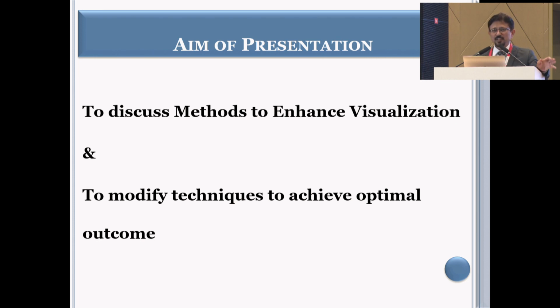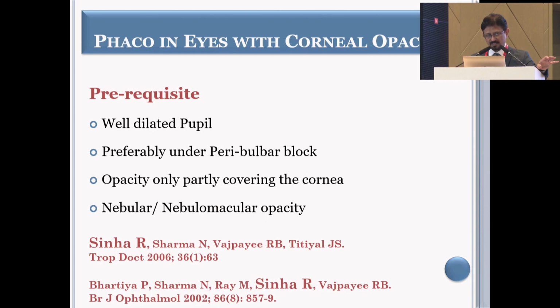The biggest issue in these cases is poor visualization because of corneal opacity and haze. What we would like to discuss in this presentation are methods or techniques to enhance visualization in these cases.